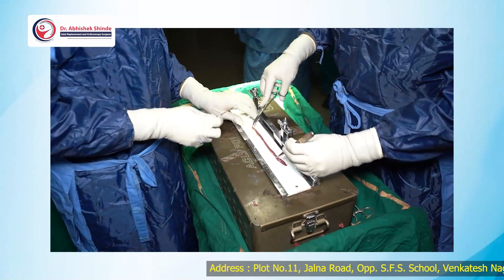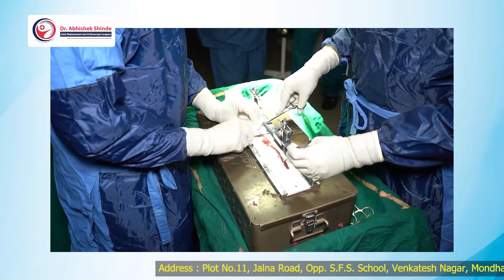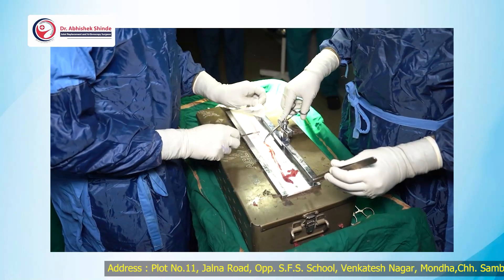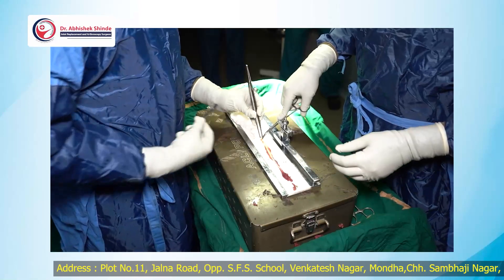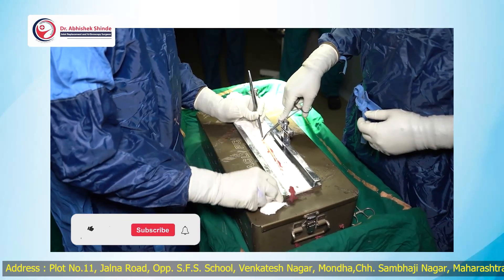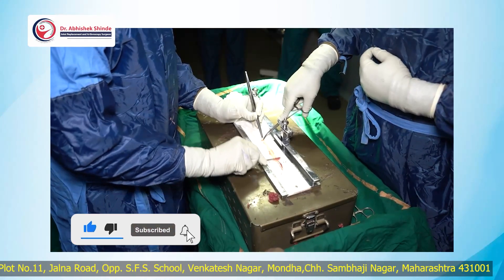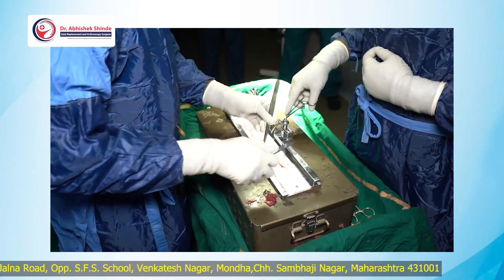In this case we have used the adjustable endo button. This is the gracilis tendon. You have to take out all the muscular attachment from the tendon and then measure the graft — only the tendinous part is to be kept as much as possible, so that it gives good strength to the graft.